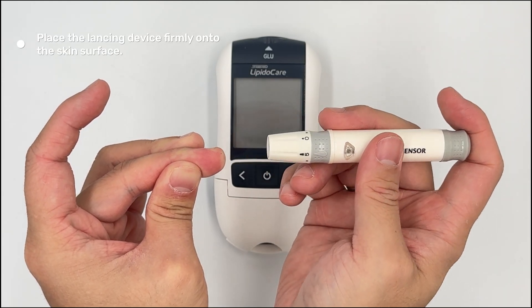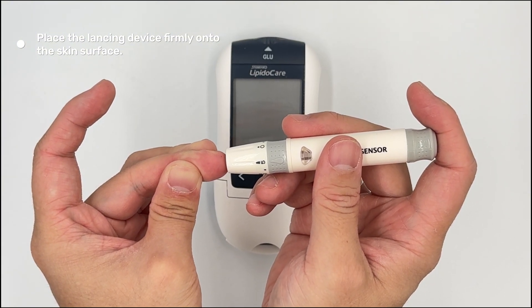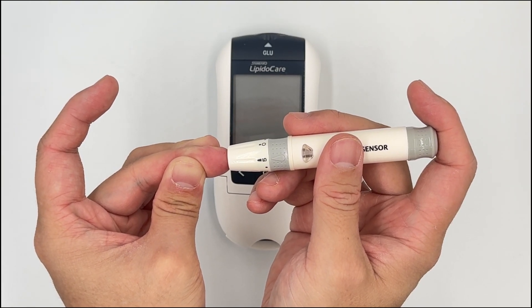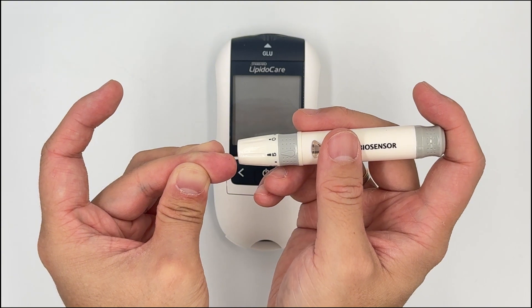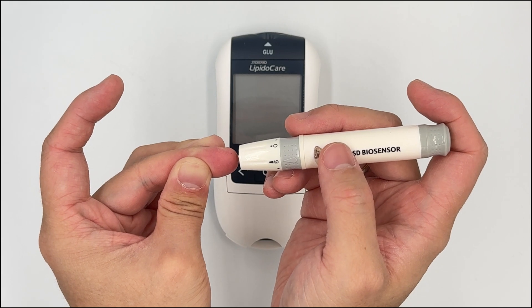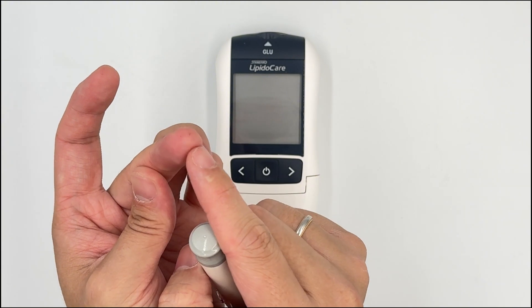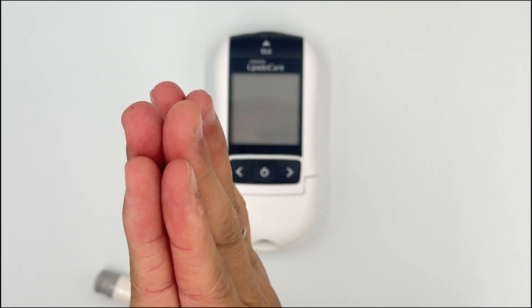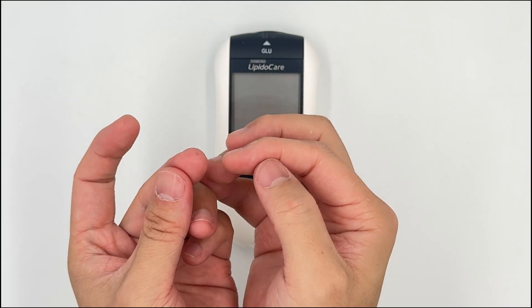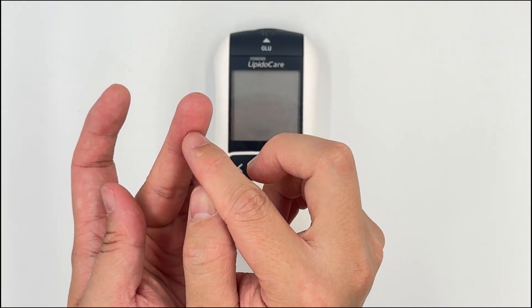A lot of people want to be gentle and just rest the lancing device lightly on the skin, but this actually makes it more painful — when you click it, the whole device shakes and the needle shakes inside the skin, which creates a more painful experience. So press it firmly on the skin and then click. Also, prick around the sides of the finger, not the center, because there are more nerve endings in the center and it will be more painful.